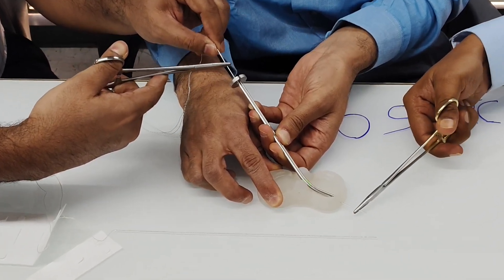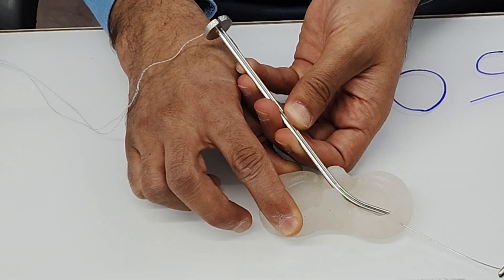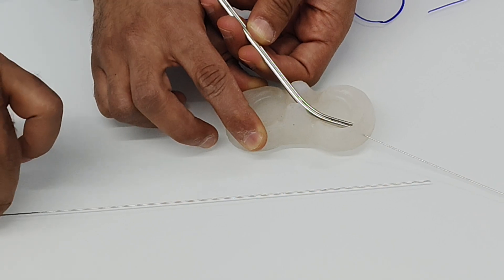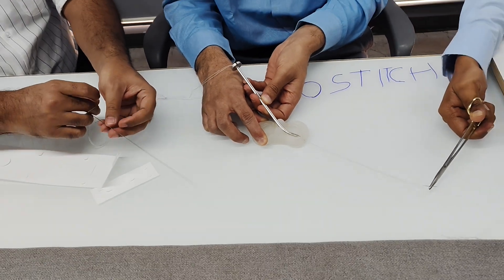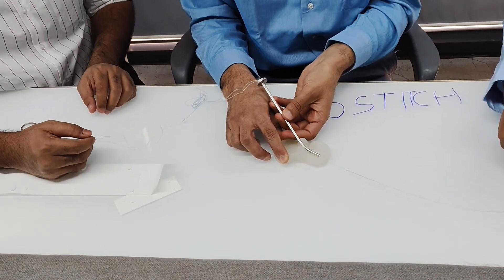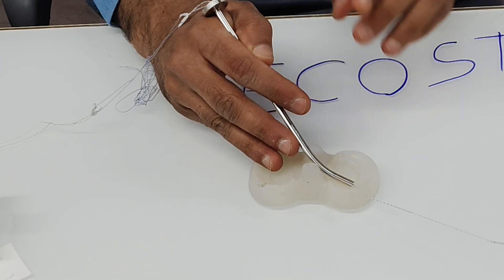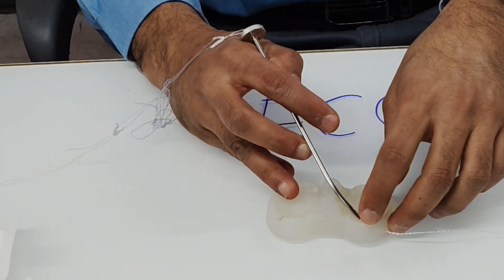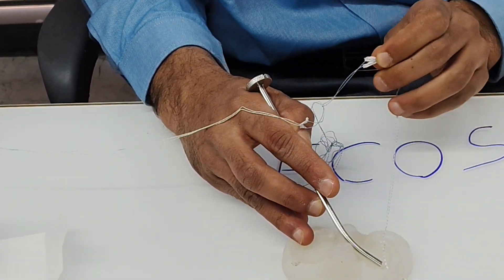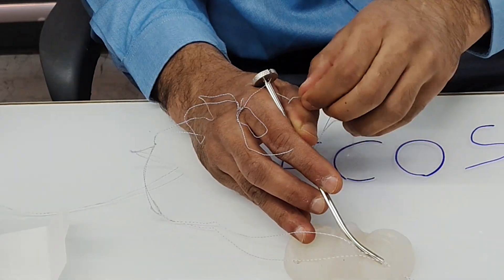Once the needle is out of the skin, the second assistant pulls the needle out of the skin. You have to pull it out until you can see the thread on the back of the knee. Once you can see the thread, take this thread out of the slotted cannula.